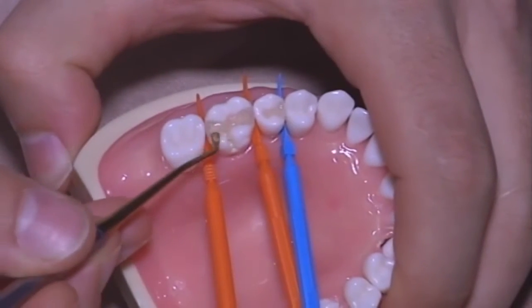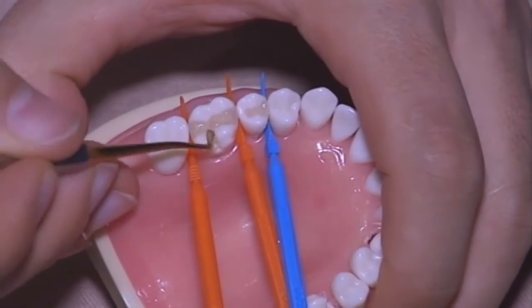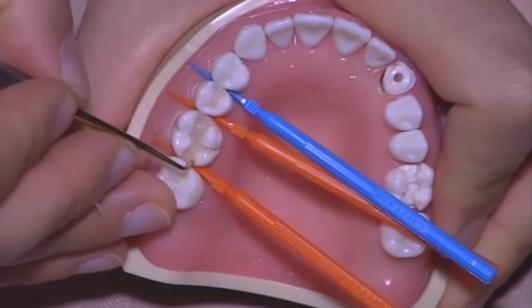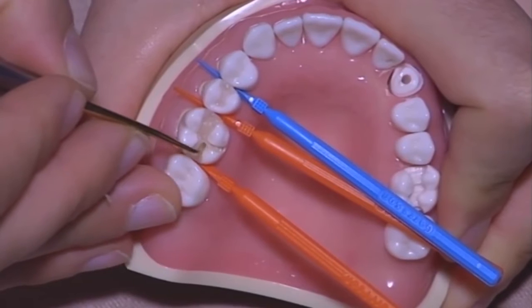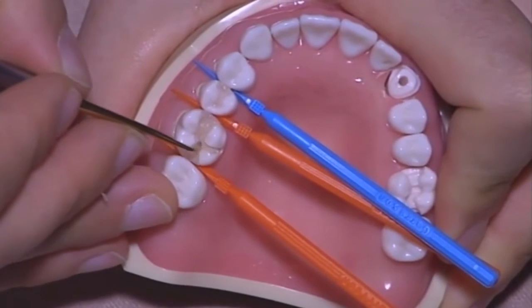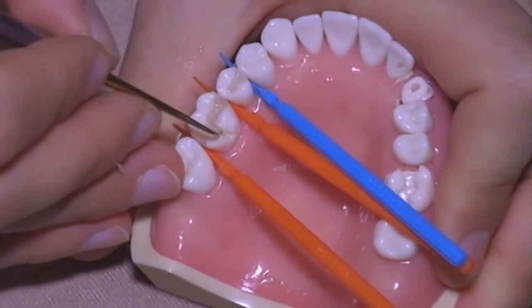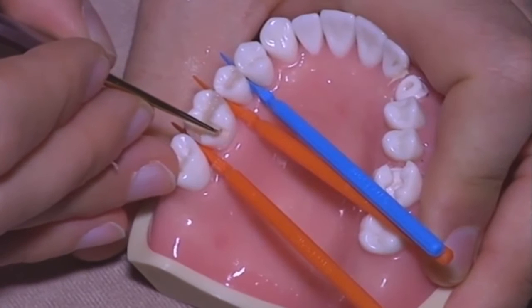Secondly, distribute it in order to leave a space for the enamel, which is going to arrive in a while.